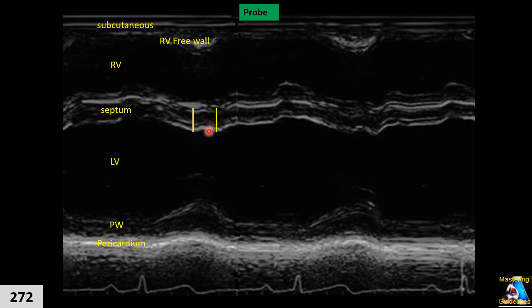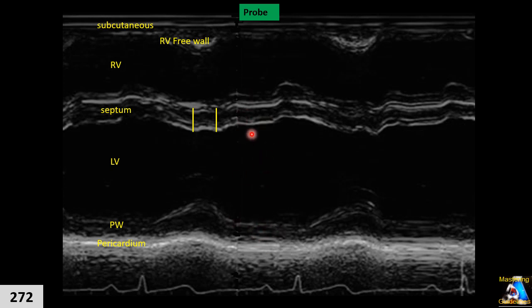This notch is a normal pattern of the septum on M-mode. After the T-wave, with the start of diastole, the septum gradually becomes flat and moves slightly upward — toward the probe and right ventricle. Through the end of diastole it slopes slightly upward, then slopes back down. These slope patterns change in pathological situations, which I'll discuss next when reviewing the abnormal septal motion patterns.